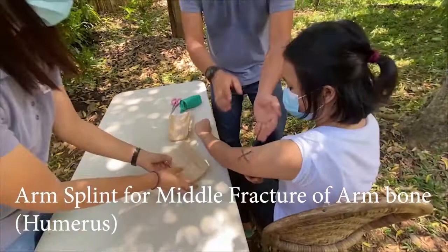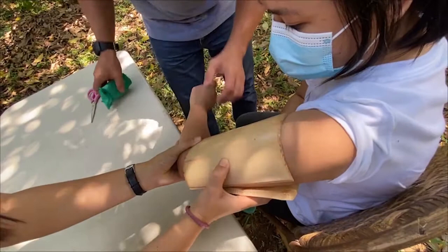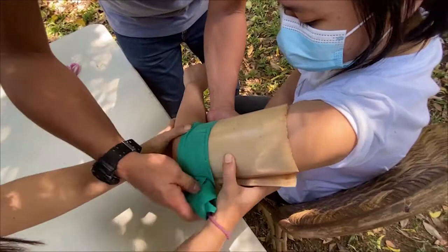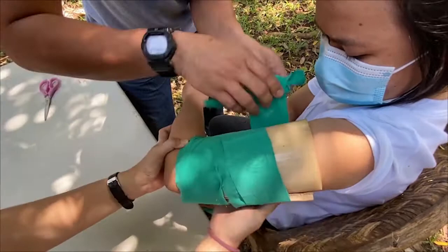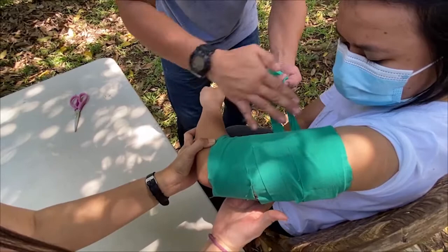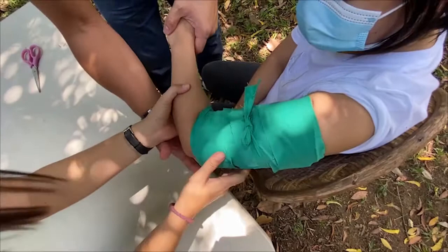Technique to make an arm splint. Get a banana stalk long enough to hold the injured extremity. It can be cut to a necessary length. Place the arm in a straight position with applied gentle traction to avoid bending of the fractured area. The splint should be long and wide enough to cover the front and back part of the arm. Mold the banana stalk according to the size of the arm. Start rolling the bandage from distal to proximal position with enough tension to hold the splint. Too much tension can cause swelling and too loose cannot hold the splint properly. Make sure to expose the fingers of the hand to assess blood circulation. If the bandage is too tight or there is an existing vascular injury, it will become cyanotic or pale. Cut the end of the rolled cloth into half and tie it securely.